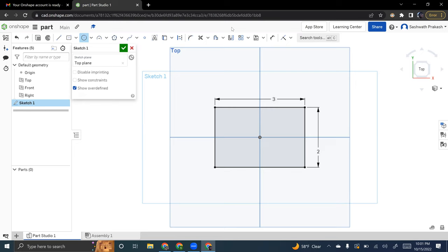Just click once on the orange line. Good. And now you can call it 2 inches. Let's click this. Control Z. You see this? So now you're on that. Click right there on the orange line and then drag it outwards, to the right, until you see the number. Perfect. Left click once. And now you can make it 2. And you're going to do the same thing for the top line.